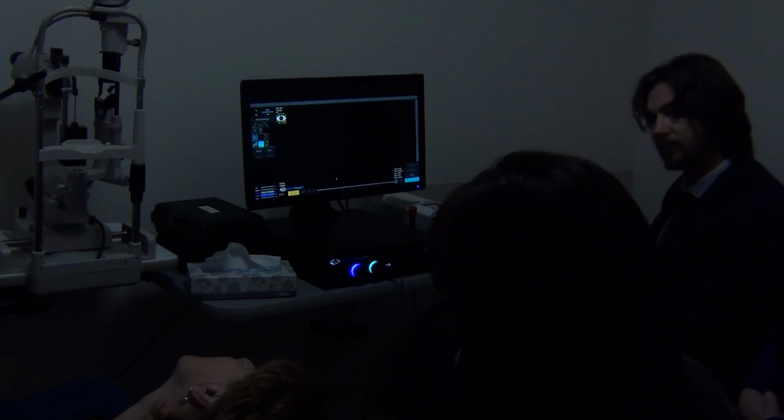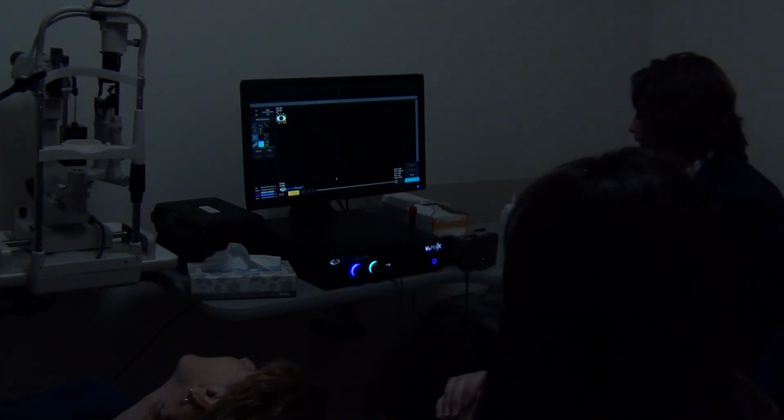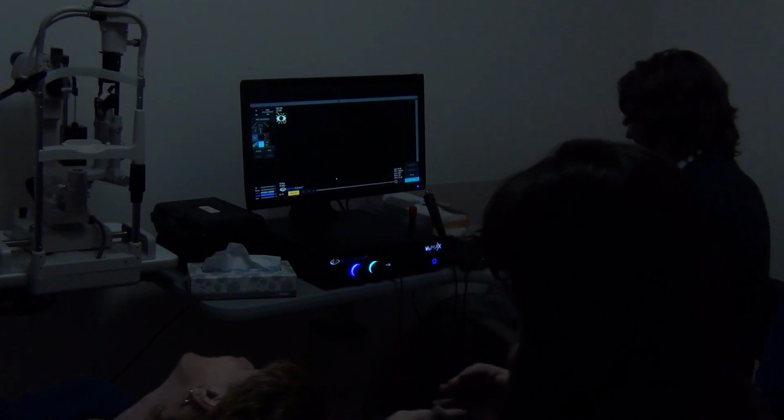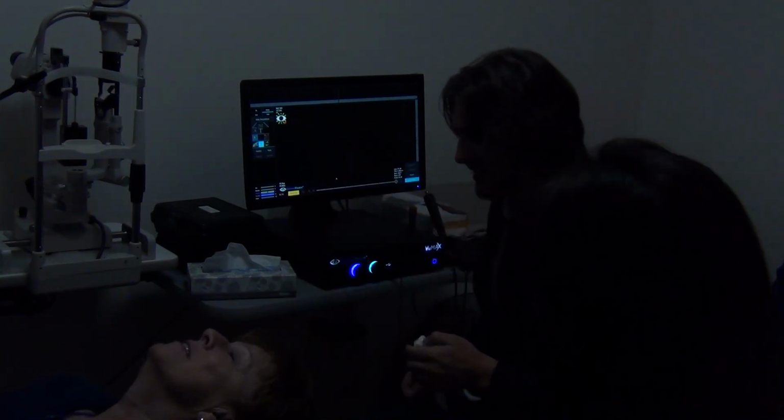Yeah, the beeping scares me at first. When I first heard it, it scared me. We can turn it off if needed, but it's really a good guide. It's just, the first time it beeped at me, I was like, whoa. Yeah, what's going on? Exactly.